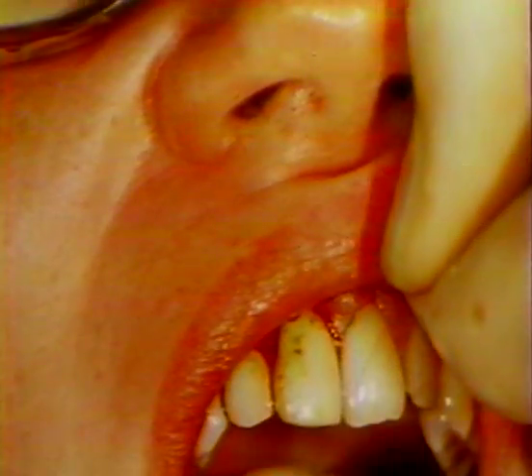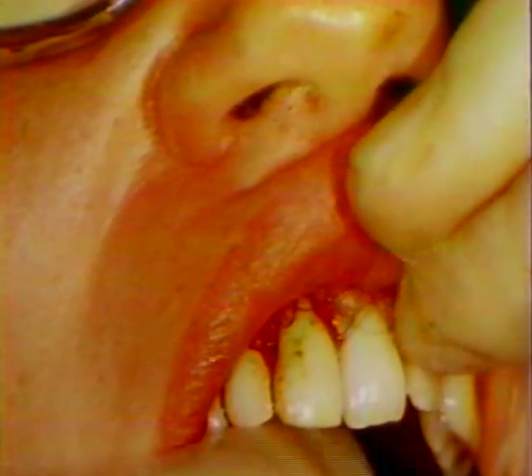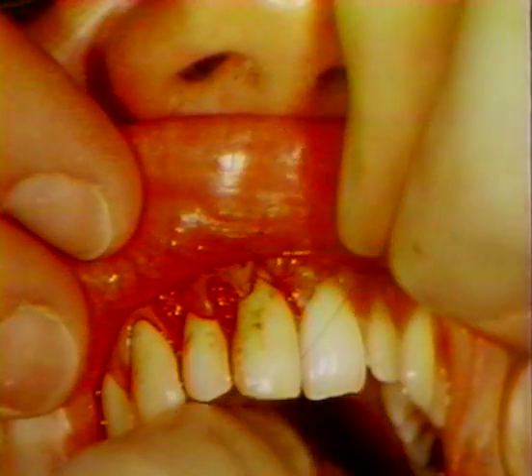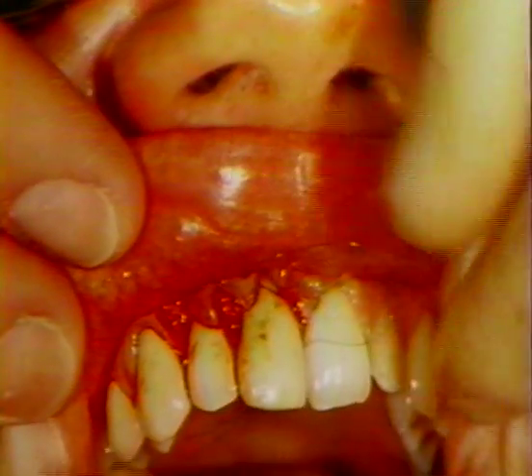One end of the suture is carefully pulled through the contact of the central incisors. Then, the other end is also drawn through the contact so that both ends of the suture are on the palatal aspect.